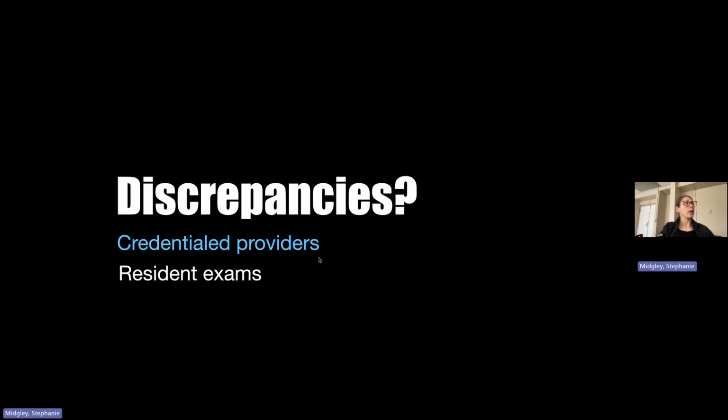And then again, discrepancies with credentialed providers are always a more important thing, right? Because those in theory should be affecting their medical management, whereas resident exams are more for education, so they shouldn't be impacting clinical care. So a discrepancy with a resident exam that ideally did not impact clinical care is more so just an informal email education, whereas a credentialed provider that measured the interior of the aorta and totally missed the AAA because they didn't measure outer to outer, right? It's going to be a much different approach. So having that delineated.